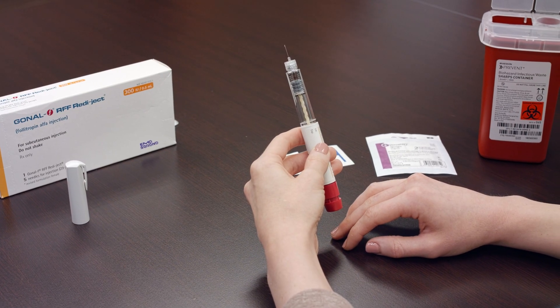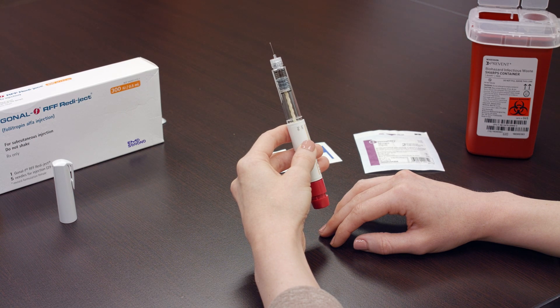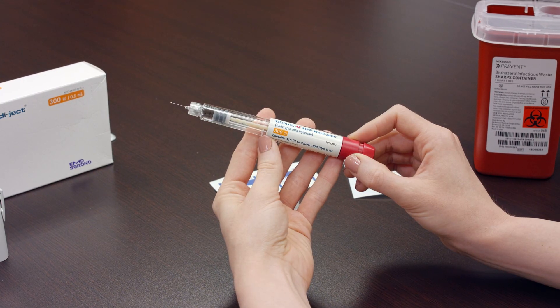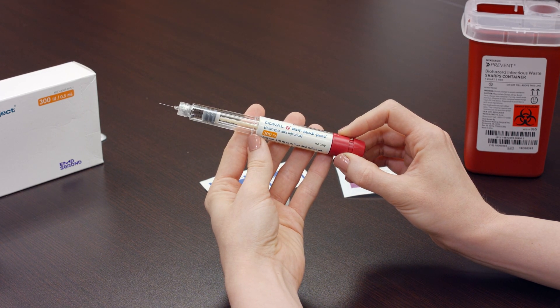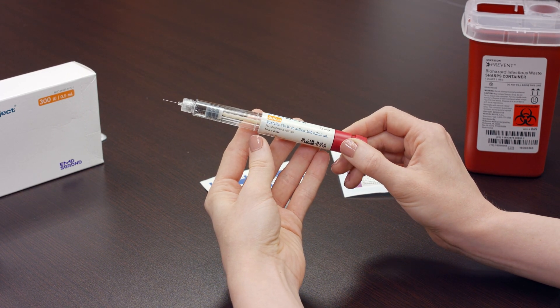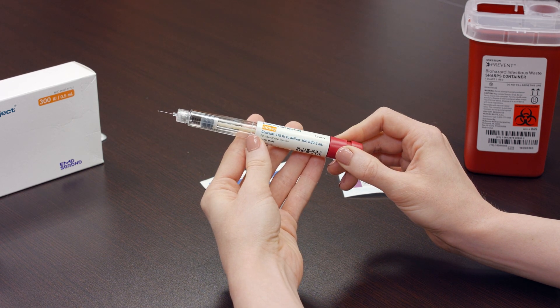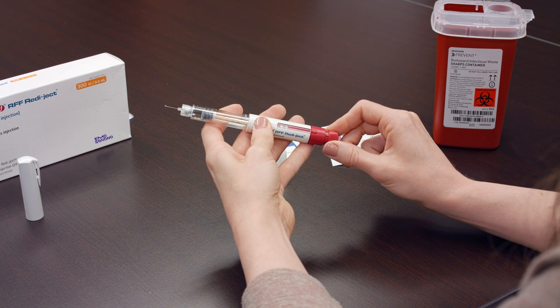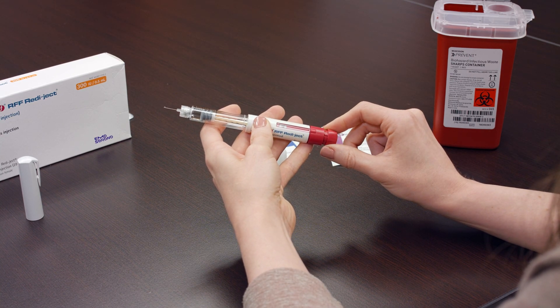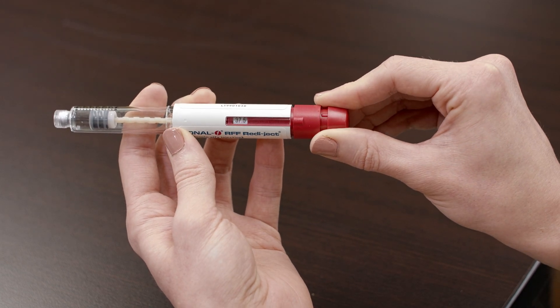You are now able to apply a specific dose to the pen for the injection. There are three separate dosages that the Gonal F pen will contain. The pens will come in 300 IU, 450 IU, or 900 IU. For any dosages between 12.5 IU and 450 IU, turn the dosage knob to the correct number of prescribed medication.